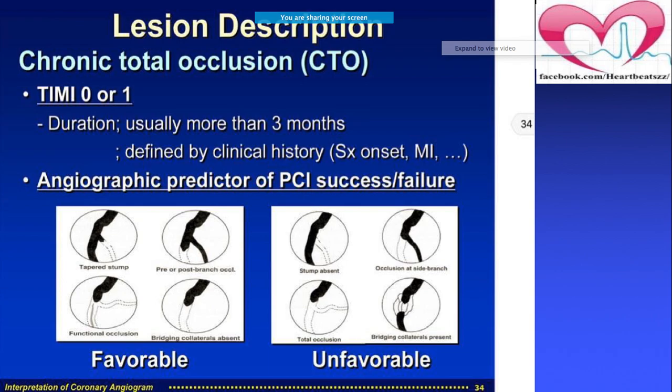Does anyone remember what bridging is? So one question: between two coronary arteries, there is anastomosis. Most of the time, bridging happens between, like this as well. But there is a phenomenon where you may come across a patient with chest pain, you have done the TMT and it is normal, negative. And then later on, when you do a CT angiography, you may also see bridging.